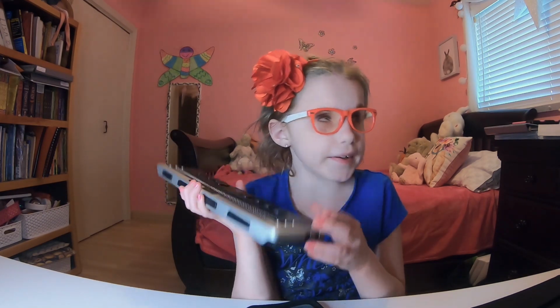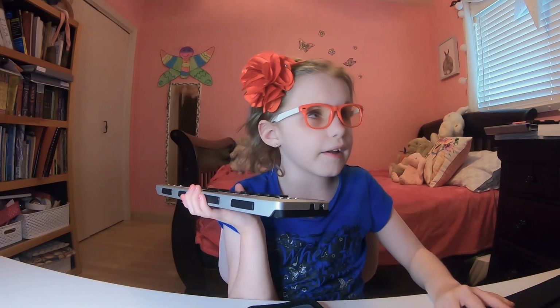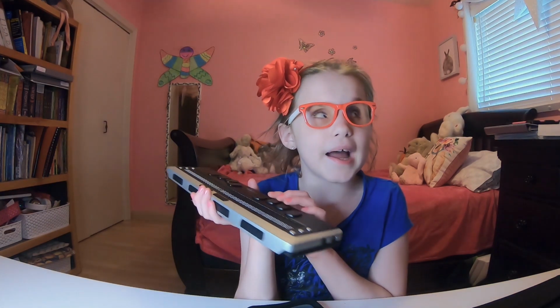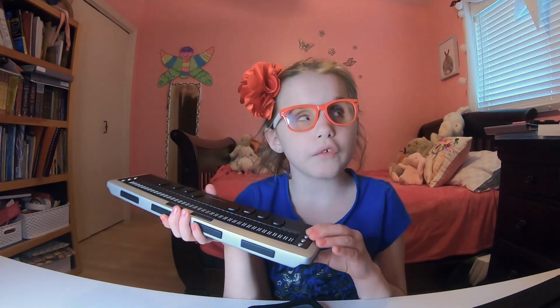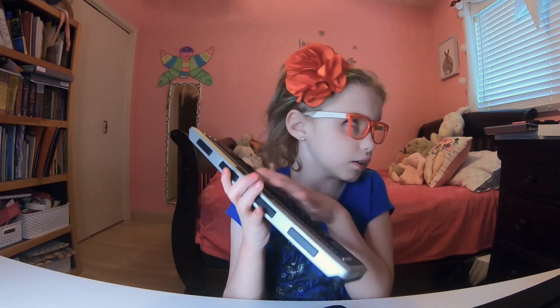One thing I want to mention is that the BrailleNote Touch is built to be accessible for visually impaired children. So I think the BrailleNote Touch is great for that. All their apps are built to be accessible, but the braille display just hooks up to your iPad. So the reason it might not be as accessible is, well, it's not your braille display's fault. It's not Humanware's fault. It's your computer or iPad's fault that the apps aren't very accessible. But it's still an awesome thing. Because all the apps that you have on your iPad, you can have on your braille display. So that's a really cool thing. I'm going to tuck this back in.